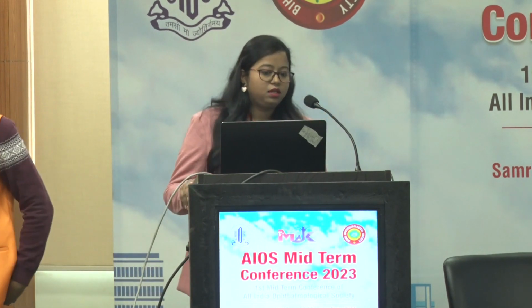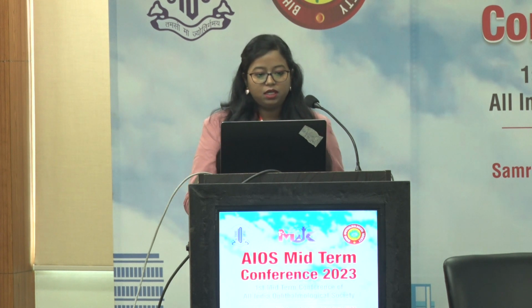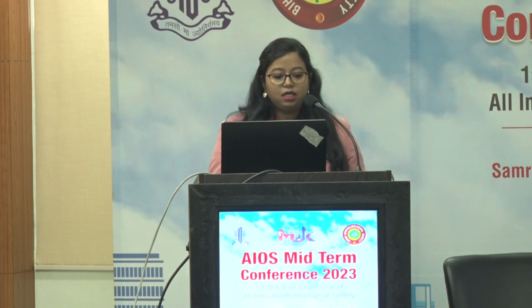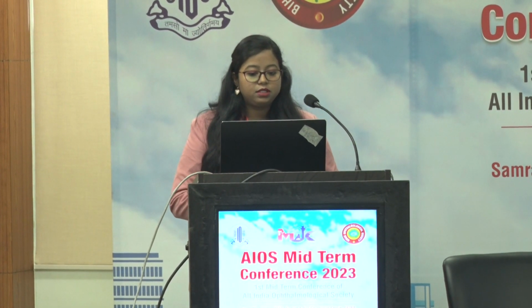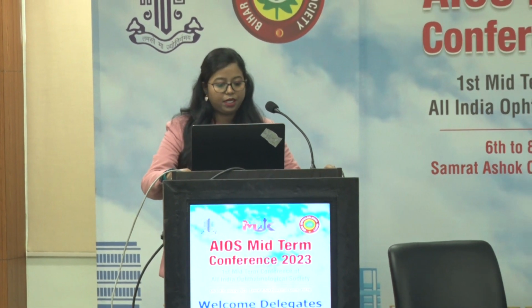Color vision testing: is an online smartphone app an alternative to the traditional Ishihara handbook? Color vision testing is the assessment of chromatic discrimination ability and diagnosis of any perceptual deficiency. It's a part of the functional assessment of the visual system by ophthalmologists. With technological advancements, a digital version of the commonly used Ishihara is now available on online platforms.